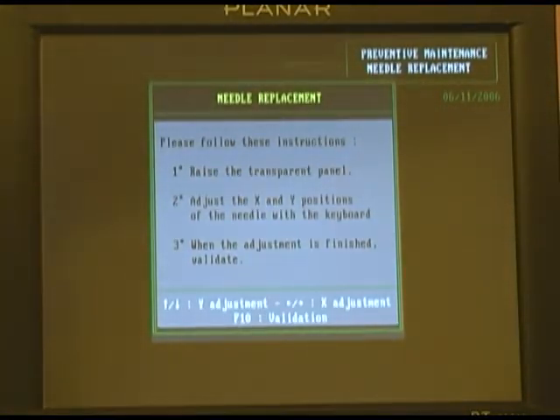The instrument will then position the needle over top that mapping cuvette and ask you to lower the needle down to just above the access hole on that mapping cuvette, and then manually hit the X or Y axes, that's the front and back, left and right arrow keys, to position the needle exactly over the access hole on that mapping cuvette, and then hit F10 once you've completed that task.